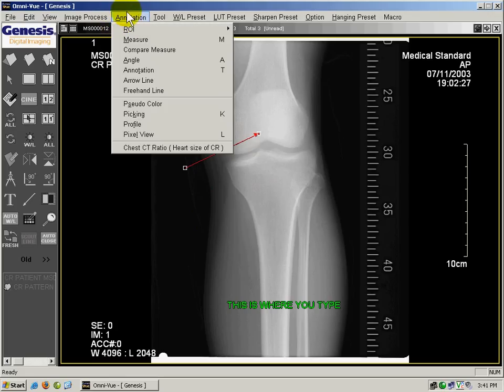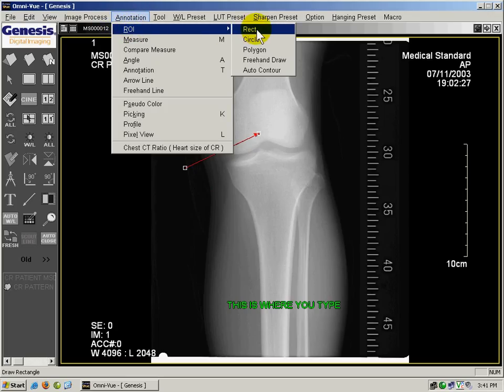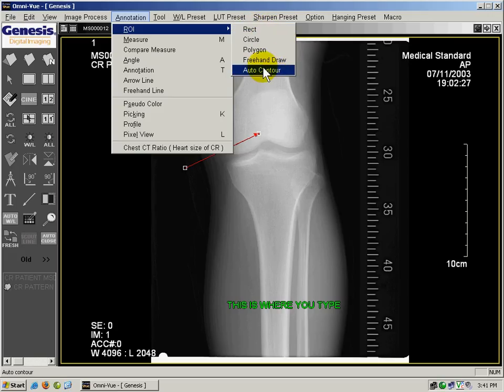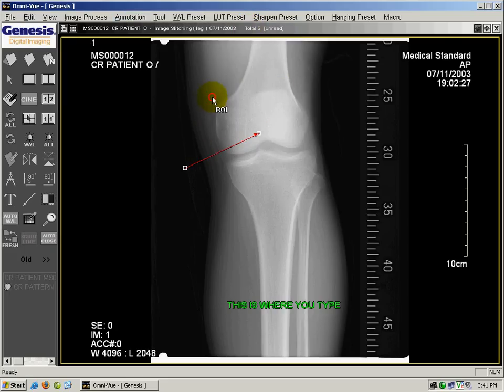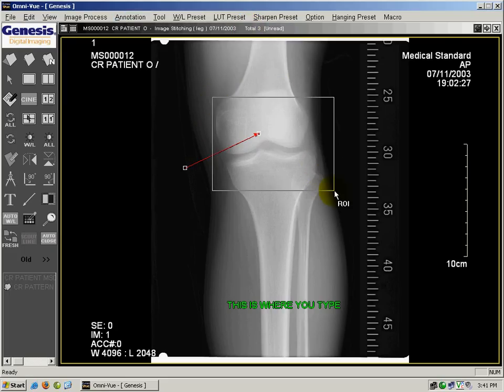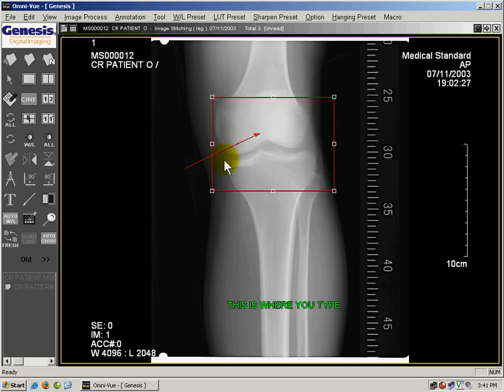Up here on the annotation toolbar, there are different shapes that you can select. You can select a rectangle, circle, polygon, and freehand draw. I'll select a rectangle and make a rectangle around the area of interest.